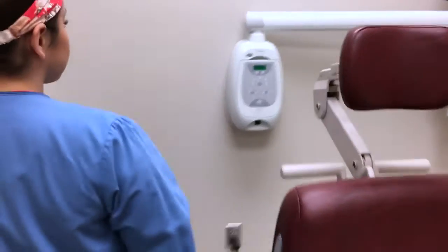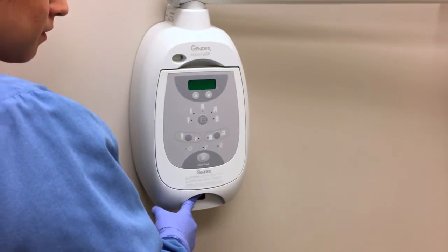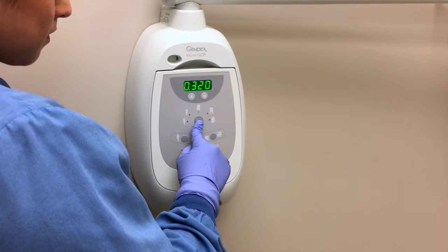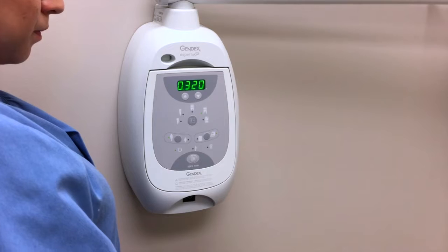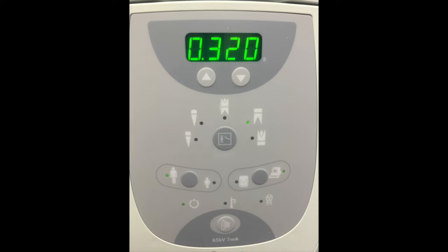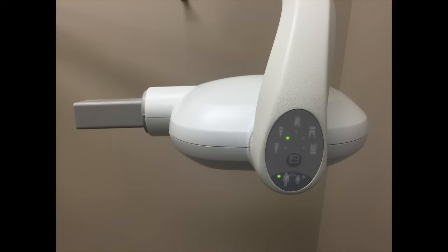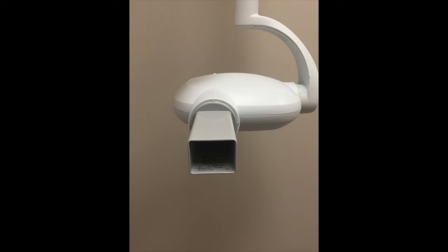The clinician must first turn on the machine and indicate on the control panel which type of x-ray they will be taking. For a posterior periapical, the position indicating device will be positioned horizontally.